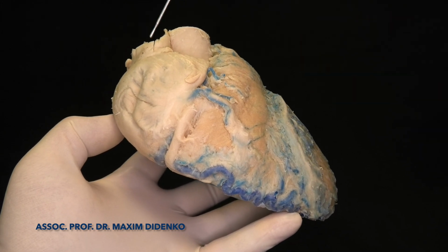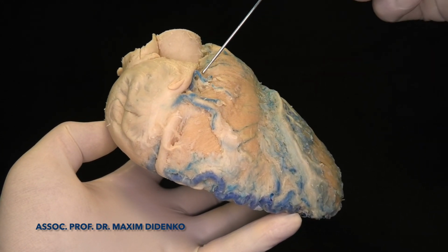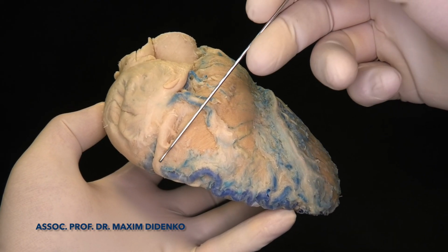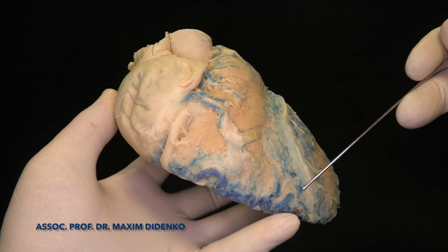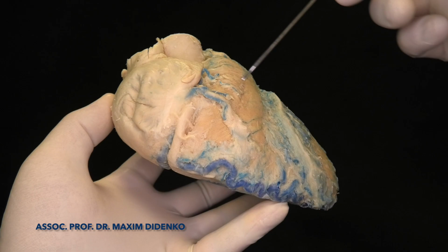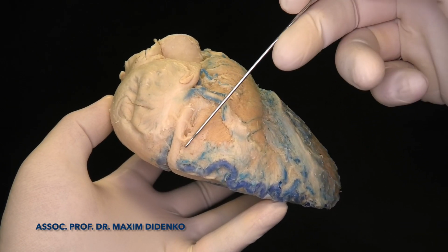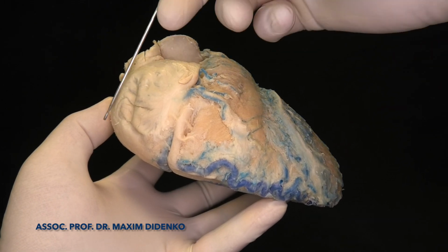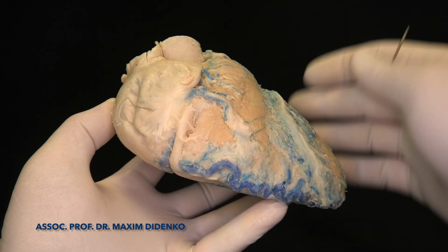We can see the superior vena cava, right atrium, and the atrioventricular groove with the right coronary artery. This is the right ventricle, and in this projection we can better recognize the position of the catheters and the structures compared to the AV groove and apex, and of course compared to the posterior side of the atria.